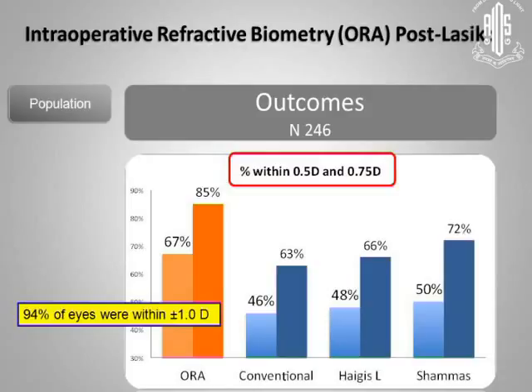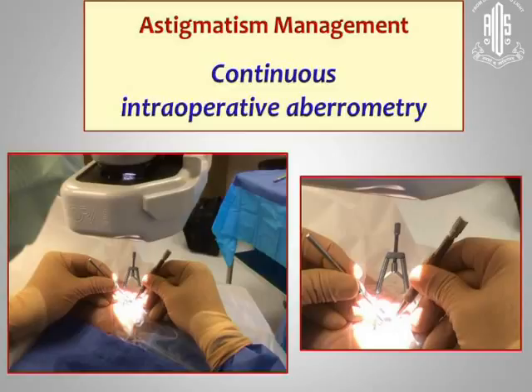And it really is independent of the clinical history method. So if they don't have their records, you're not sure how reliable they are, this bypasses that. And that's probably the main reason that drove us to do the Aura system. But what about astigmatism?